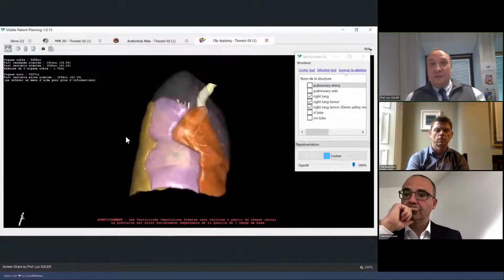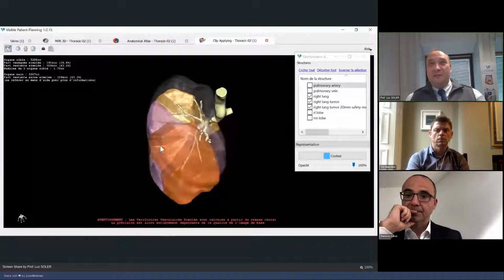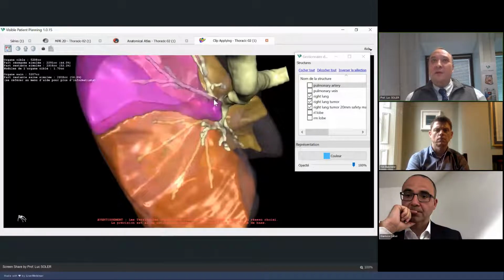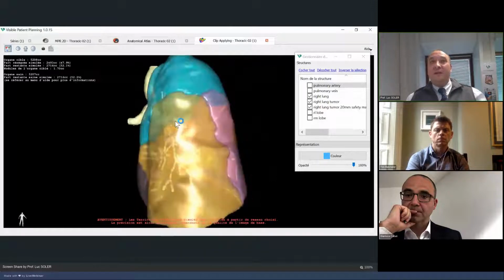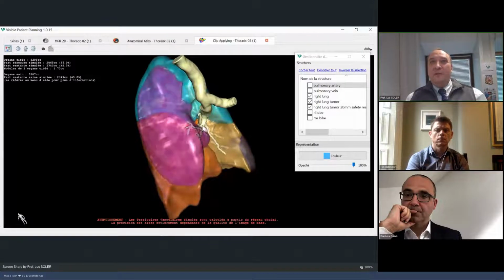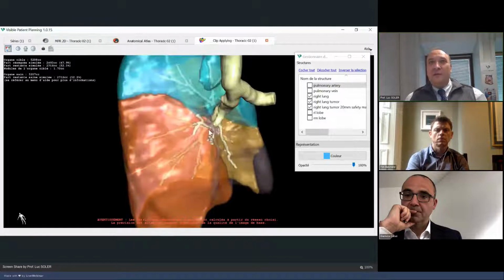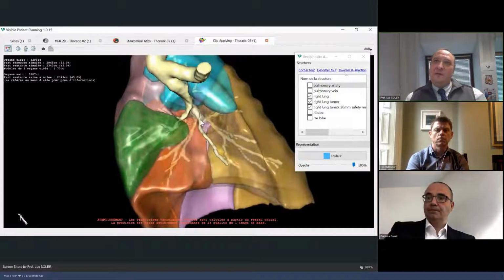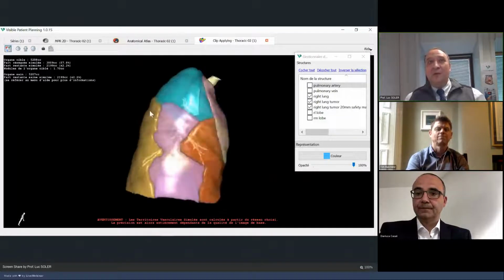You see the shape is totally unusual. Why? Because we haven't got the upper lobe. If you look at the branches here, the branches of segment 6, we can see really clearly that this lung has a location of the segment 6 that replaces, of course, the usual location of the upper lobe. You have the middle lobe here, that is correct, with segment 4 and 5. 4 and 5 here, 4 and 5 here. And in the internal view, you see we have the segment 7. So here you have this patient-specific segmentectomy after upper lobectomy.